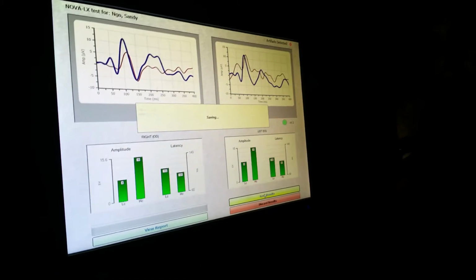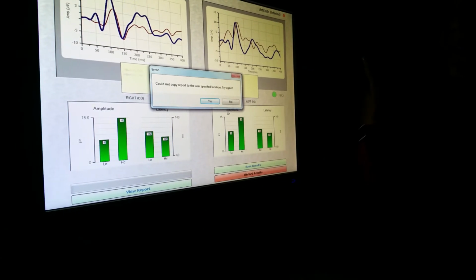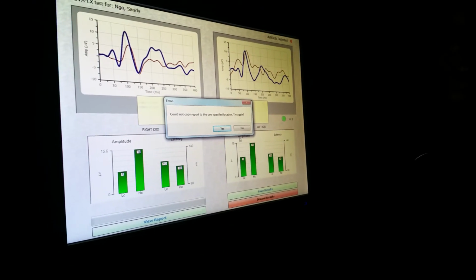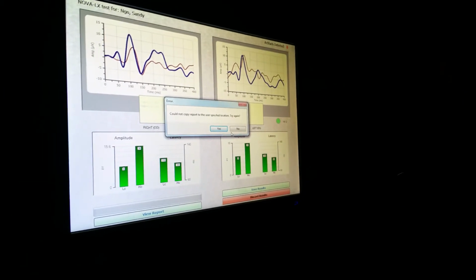Keep in mind, right, keep in mind that whenever we're doing a VEP, we're actually measuring brain waves, right? So if our patient is sitting there thinking about all the things they have to do in their head, doing their laundry list of things, I've got to pick up my kid, I have to go to the grocery, how much longer is this test going to take? Exactly. That's going to mess with your test results. So if you just let them know that they're about halfway there, it kind of helps them say, okay, I've got this, I'm going to stay focused. It's just an easy way to help them.